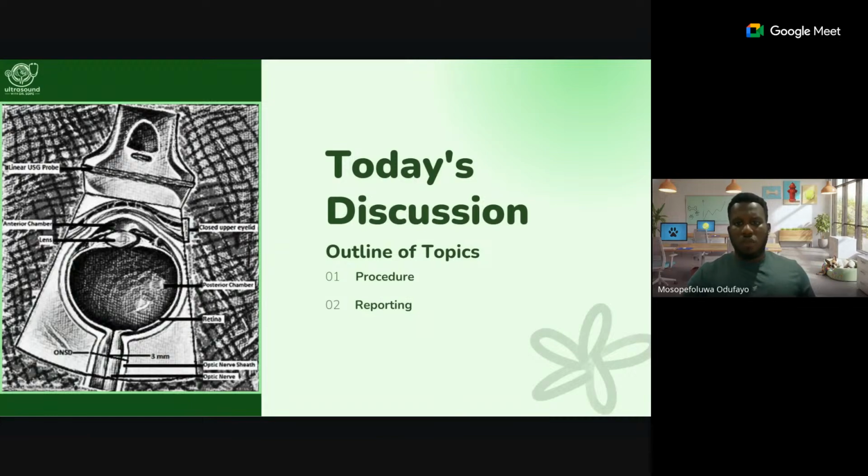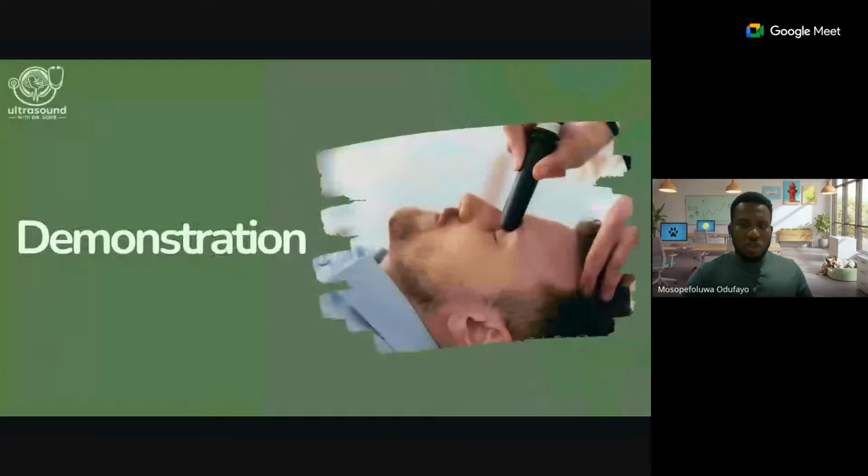First of all, I will be guiding us through how an ocular scan ought to be done, how we ought to perform this procedure, the protocols we're supposed to use, and how it's going to be carried out. A lot of people just put the probe on the eye, but a lot of things are not done the most appropriate way.